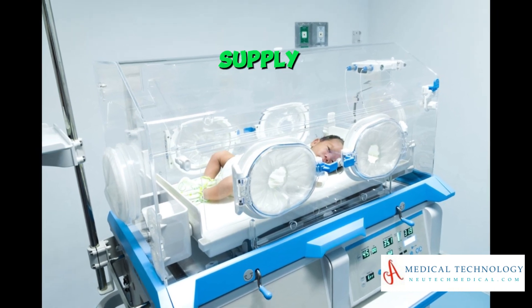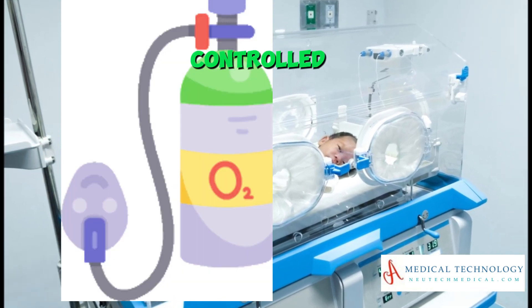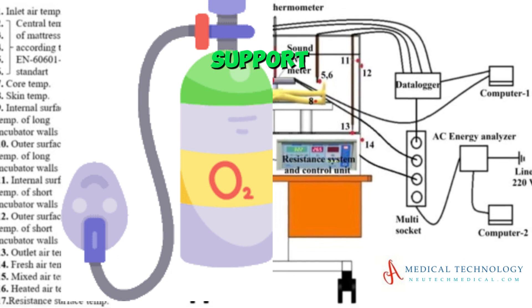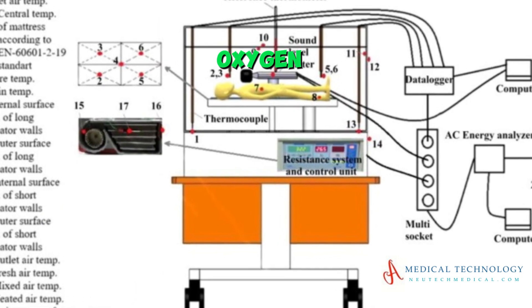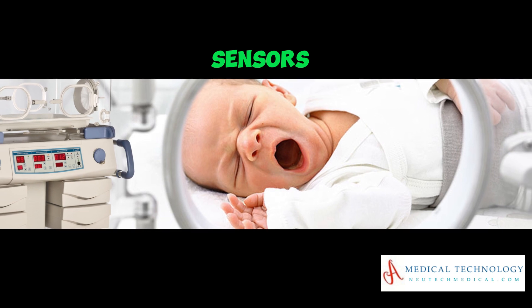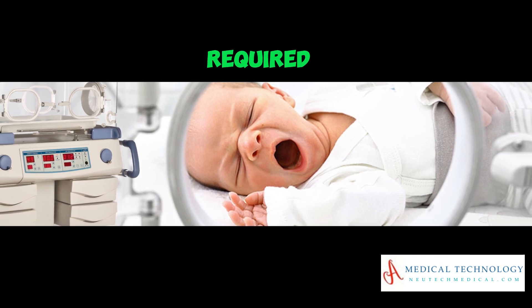Oxygen supply: If necessary, provide a controlled supply of oxygen to support the baby's respiratory needs. Monitor oxygen levels using the built-in sensors and adjust as required.